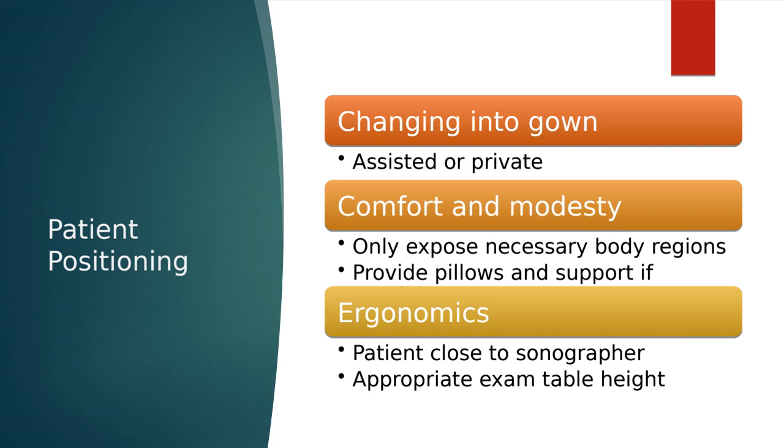If we're in the hospital, most of our patients are already going to be in gowns. So it's kind of a use your judgment scenario. You'll see techs doing different things everywhere, but you want to make sure that if someone is coming in looking very professional, very put together, they look expensive, you want to offer that they change into a gown so that we don't get gel on their clothes. Typically, those patients are going back to work after their exam.